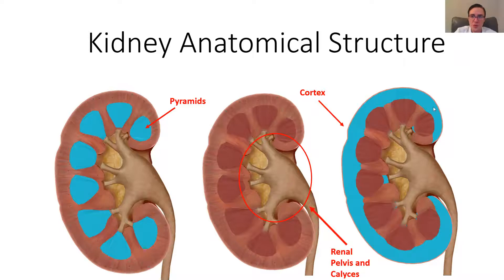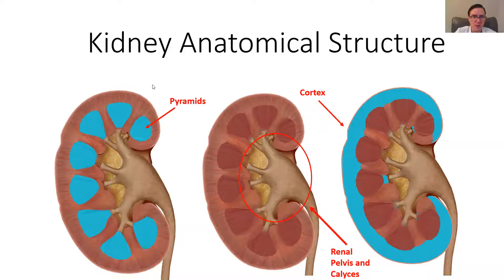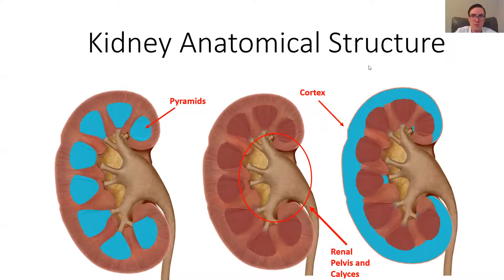It's important to talk about the internal structure of the kidneys. The cortex is a thin outer layer, and you can measure it from the capsule to the darker pyramidal shapes, which are the medullary pyramids — this should be about six millimeters or more. Less than that can be indicative of chronic kidney disease. The cortex and medulla are both part of the parenchymal kidney, and that should be greater than about 15 millimeters — if it's less than that, that's also a cause for concern. In the middle is the renal pelvis and calyces, the collecting system where you can find a lot of stones, and it should appear bright white on ultrasound.